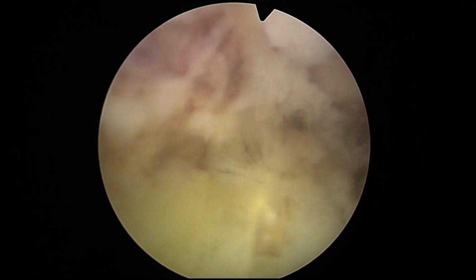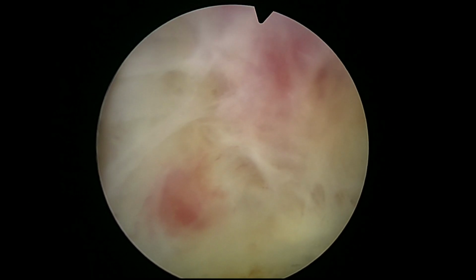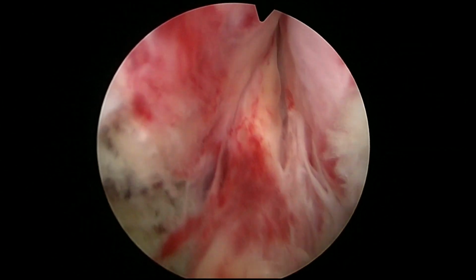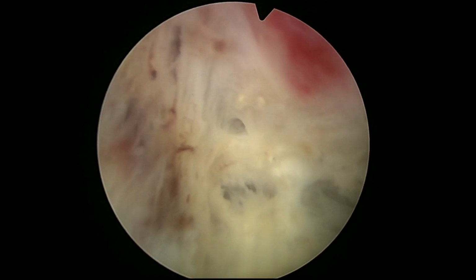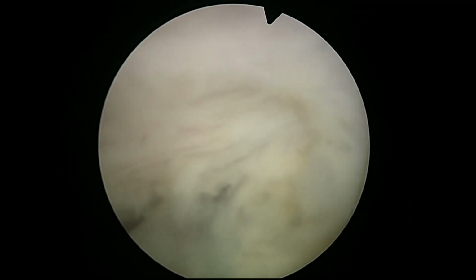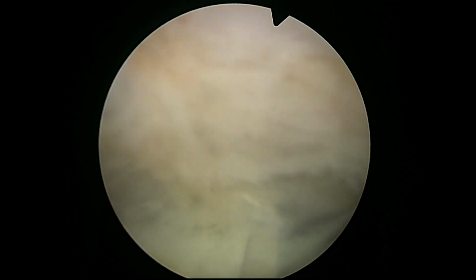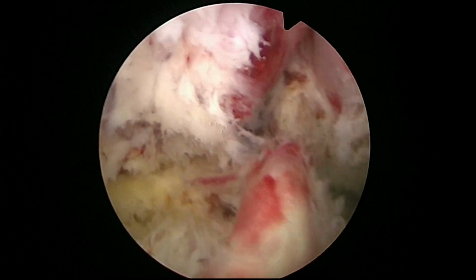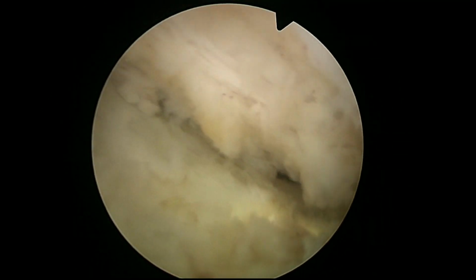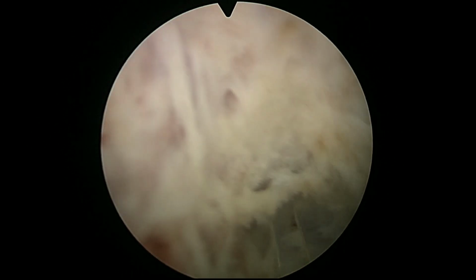One of the striking things that happens often, and in this case it was like that, is the sensation that the cystoscope is totally fixed. You cannot move the scope from side to side. It's very inelastic. The prostate is very rigid. So you have to carefully try to advance and provide mobility to the adenoma by gaining little advantages, little improvements, and going from one side to the other to see where you can gain this mobility. You will see that in some areas the tissue looks very yellow, very strange, and in some other areas we would have the impression that we are finding a plane.